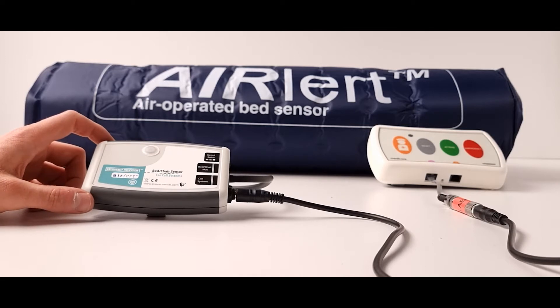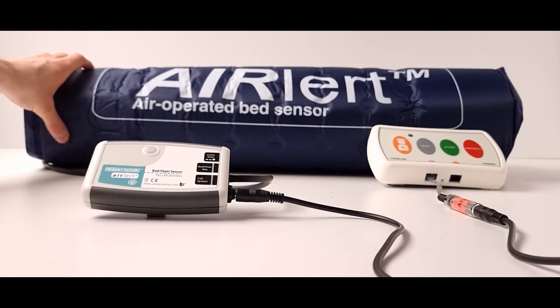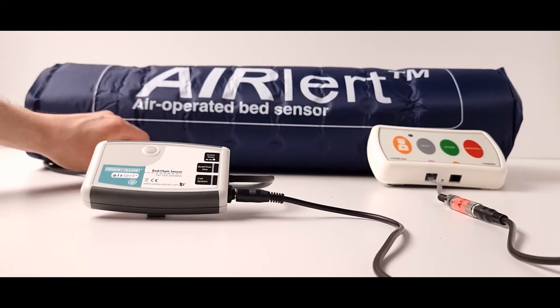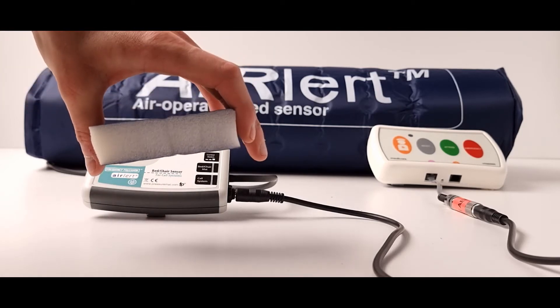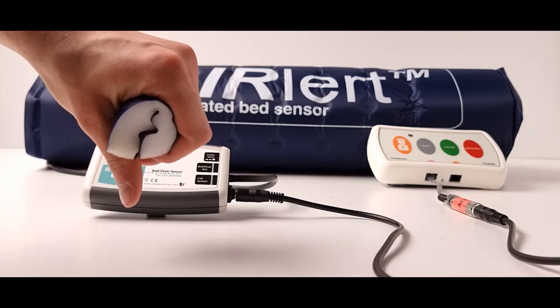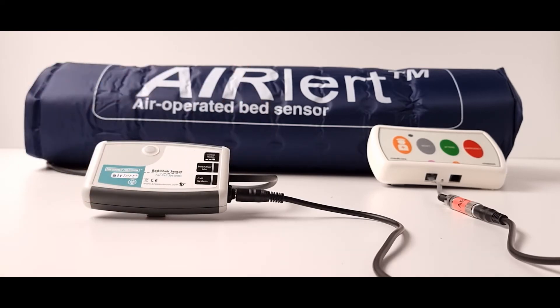The sensor consists of a battery powered control box which is connected to a full single bed size under mattress sensor pad using a piece of rubber tubing. The sensor pad is unique because it contains no electronics but consists of a layer of open core foam which can be rolled up for storage or folded and so is suitable to use on a profiling bed.